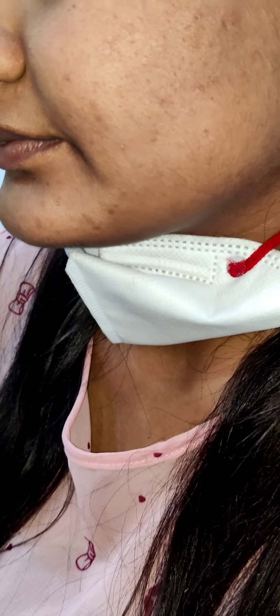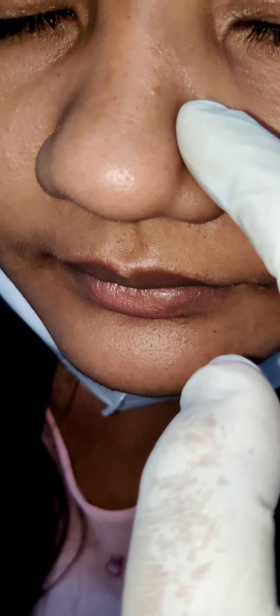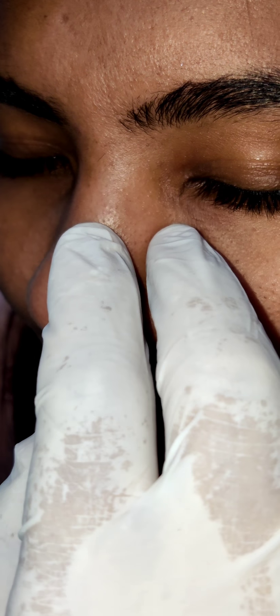The upper deep cervical group — that we should palpate in the posterior group. We should also perform palpation of the nose itself. Palpation will tell us where the swelling is, whether it is in the cartilage part. This upper part is formed by the nasal bone, and the lower part is formed by the lateral nasal cartilage. This is the junction of the nasal bone and cartilage part, and that is the common site of opening of a congenital dermoid cyst.